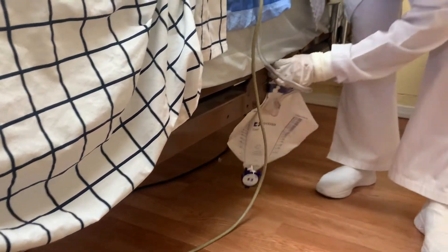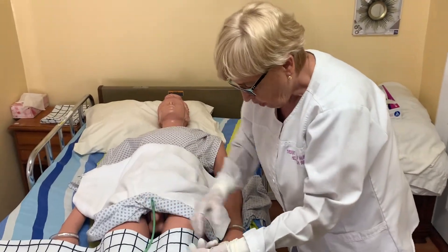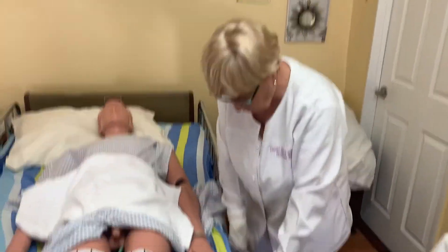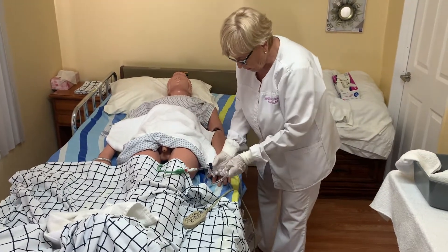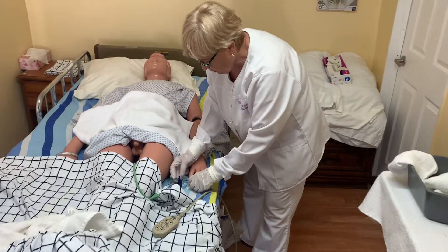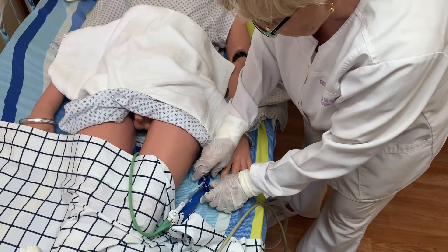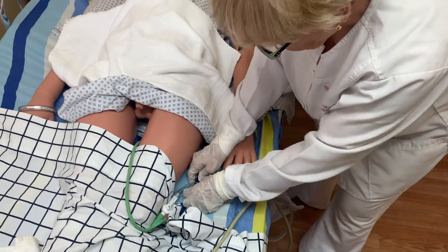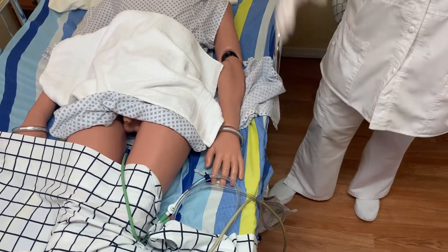The bag should always be hung on the bed frame — not the bed rail. Never on the bed rail, because if you put it on the bed rail and you put the rail down, you are going to pull the catheter out. The urine drains from the bladder into the bag. For better drainage, the tubing should be looped like a bowl. They have a clip to fasten the tubing to the sheet so it stays in that position — urine drains better that way than if the tubing goes straight.